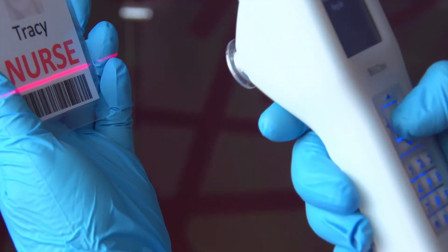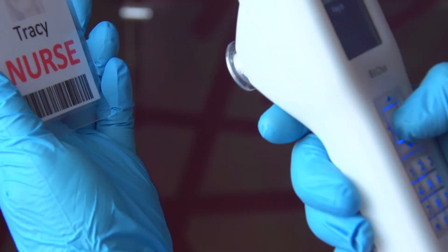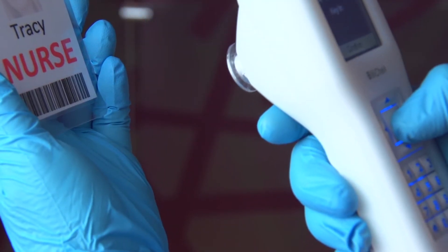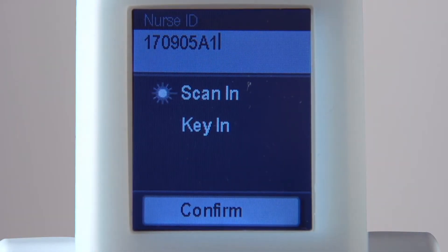In this case, we'll use the barcode scanner. Highlight Scan In to activate the barcode scanner. Point the scanner towards the barcode and press the Enter key. The scanned information appears on the screen. Confirm the information is correct and press the Enter key.